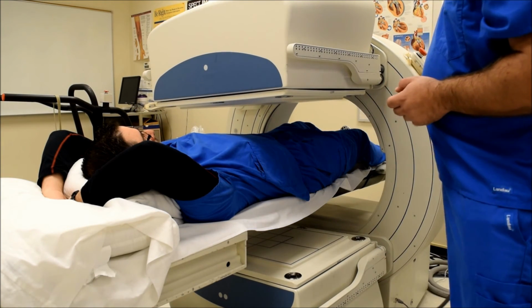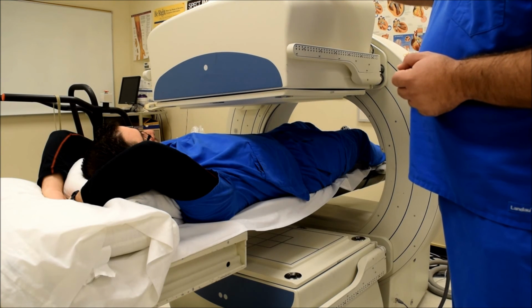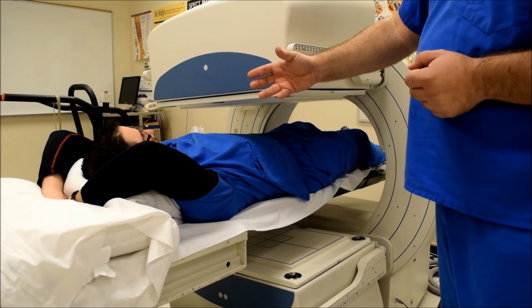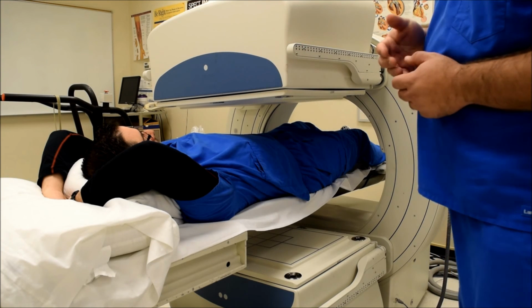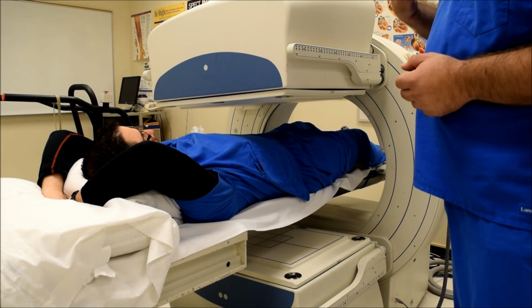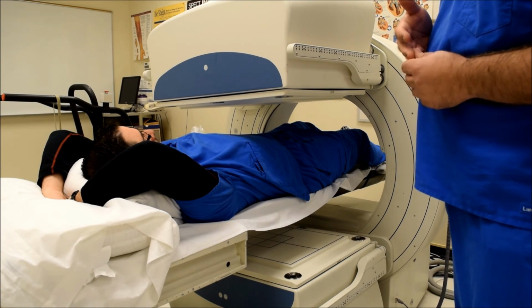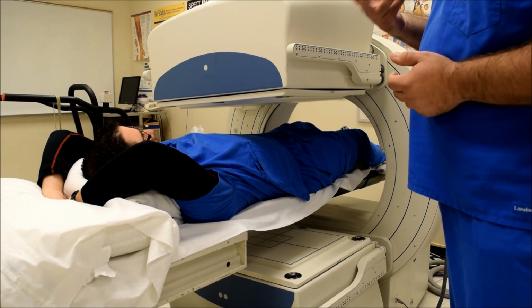Once we have it in this position, we'll enter our protocol information. At that time, the camera's going to move a step at a time, turning counterclockwise, taking pictures 360 degrees all the way around. Once you're done, the computer will rebuild it into an image that the physician can go through and look at different slices to get a better idea of where the lesion or the area of uptake is that we're looking at.